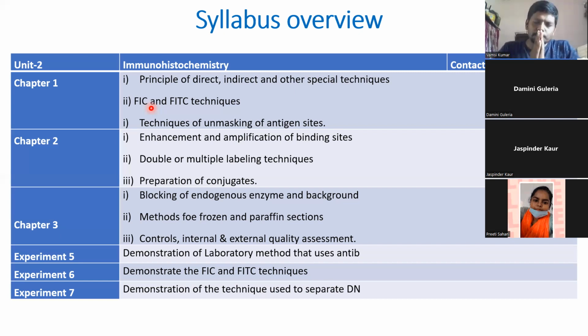Okay, now say for example, we are going to detect an antigen, prostate specific antigen, which is very closely related with peroxidases. Peroxidase is present in the prostate gland. Peroxidase is also present in red blood cells and in some organs of our body. Peroxidase is a common enzyme in those organs.